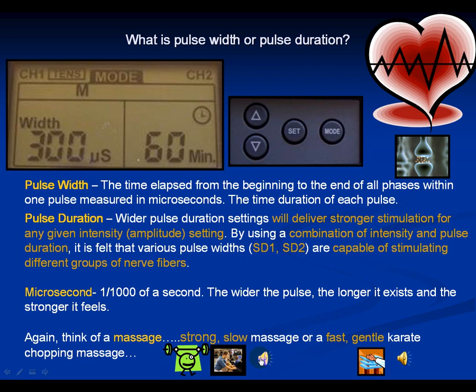By changing the pulse rate and width while practicing on your thigh — a large muscle group — you'll get an idea of what these sensations feel like.